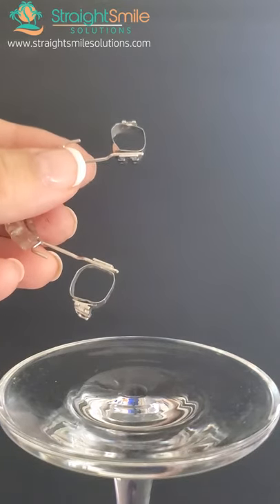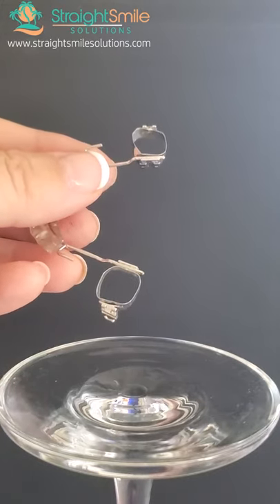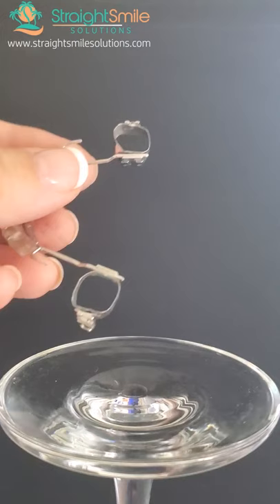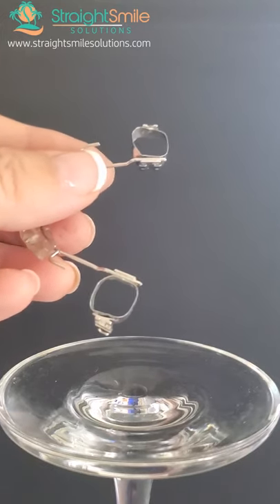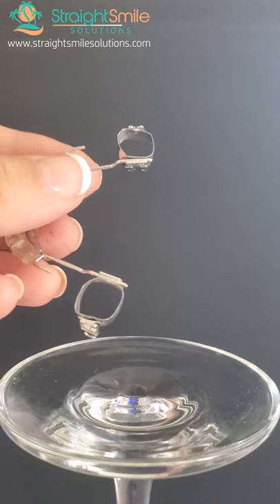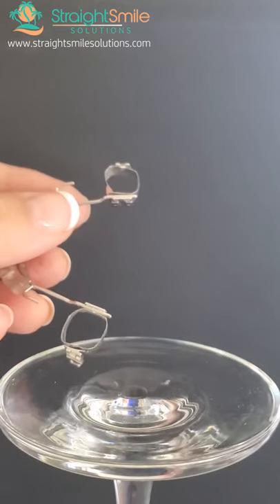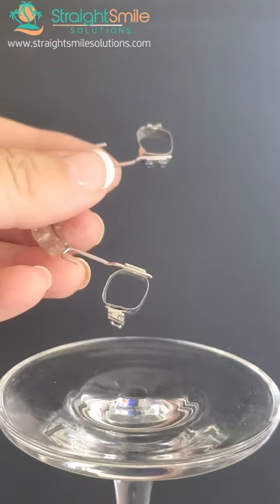Bandlock comes in colors. When you load it and allow it to light cure, it's going to change to clear from — I think it's purplish, purple-blue. But if the fit is not very tight, I recommend using a Fuji-based modified glass ionomer because it's a little bit thicker. I wouldn't use that unless you really need to, because you're going to have a hard time getting it off.